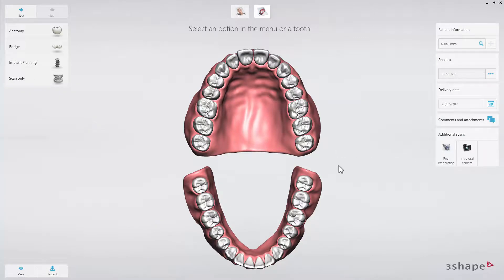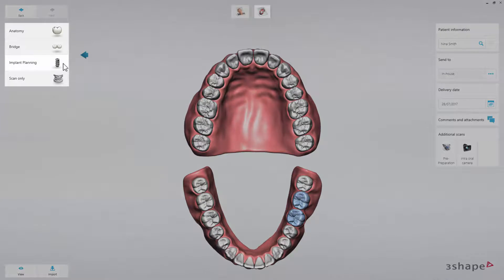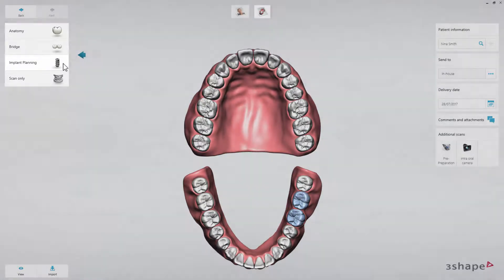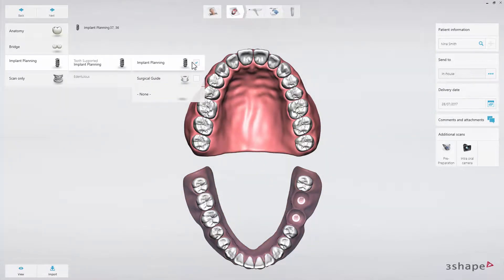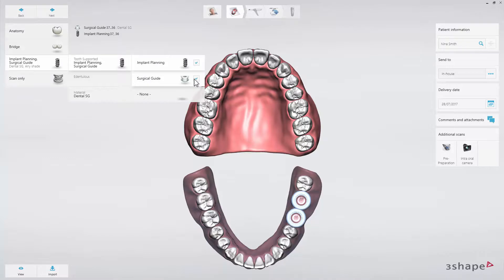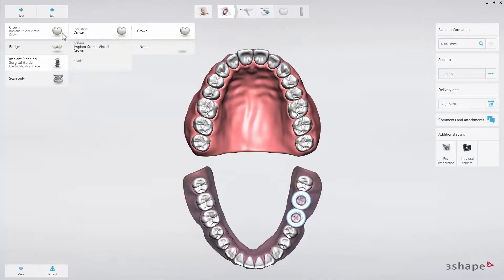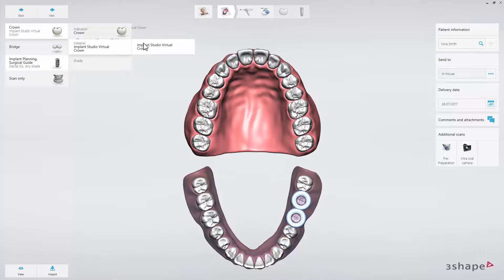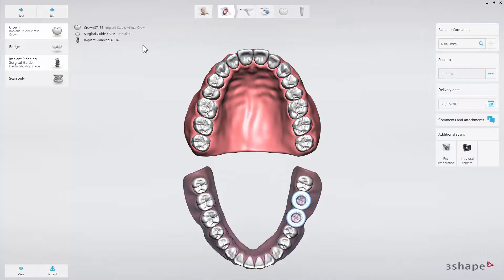In the 3D order form, select the relevant teeth with a mouse click and choose the desired indication from the available list — either implant planning only or include a surgical guide. This example shows a case with crowns, implant planning, and a surgical guide design.